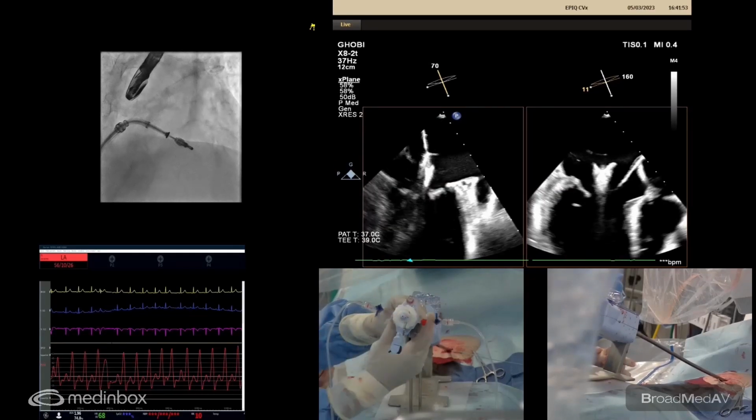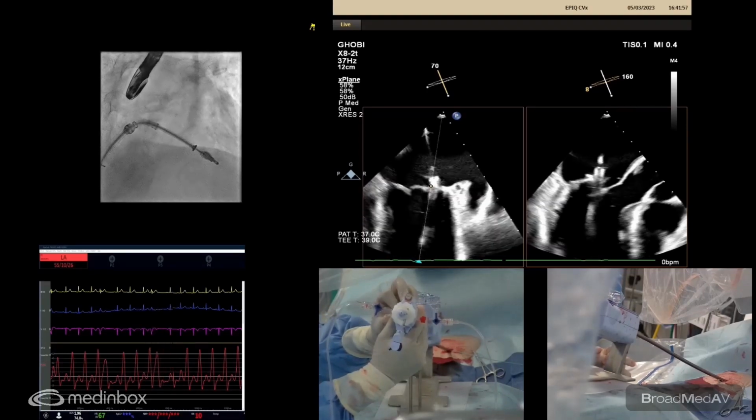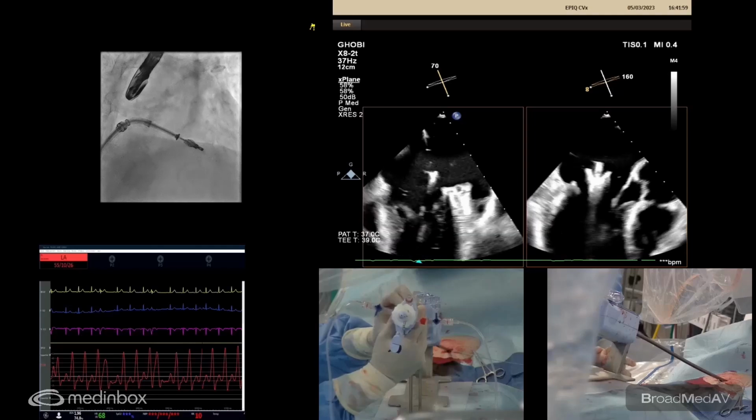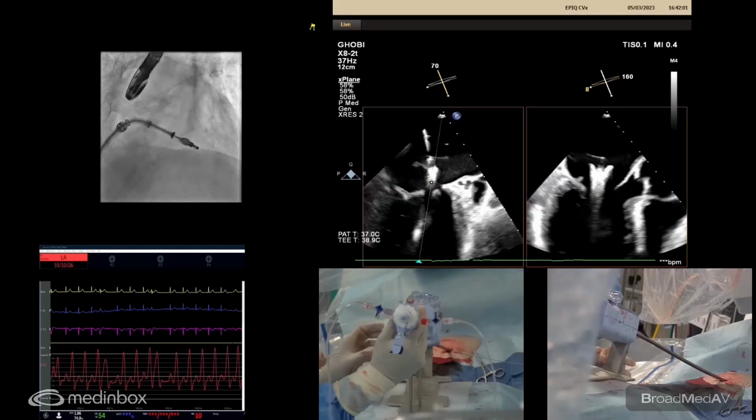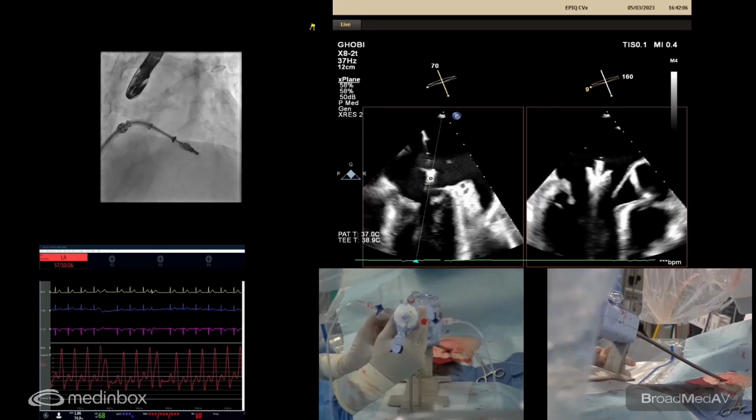This is the disadvantage of the system, that you don't see both the arms well. Yeah. When you're in MPR, you did. So you see, you had a lateral dive there. I saw that. Maybe let's correct it above the valve. Yeah, I just corrected above the valve. Good.